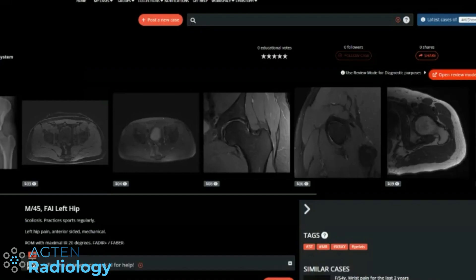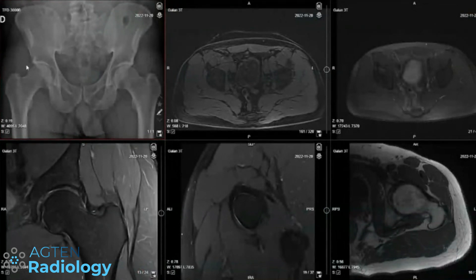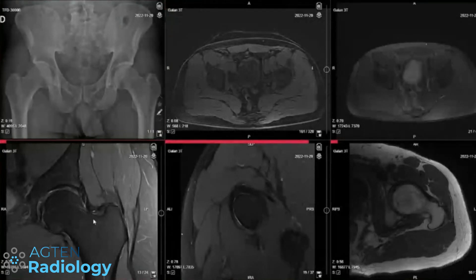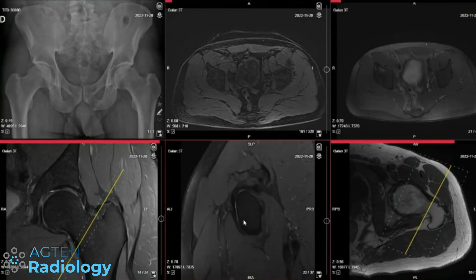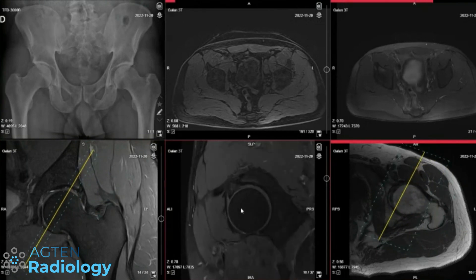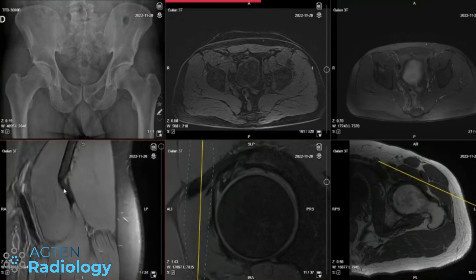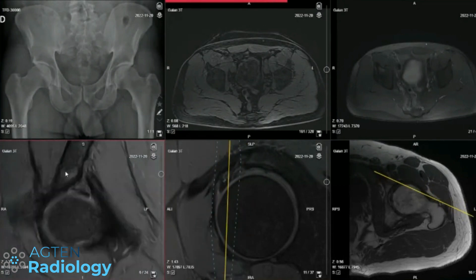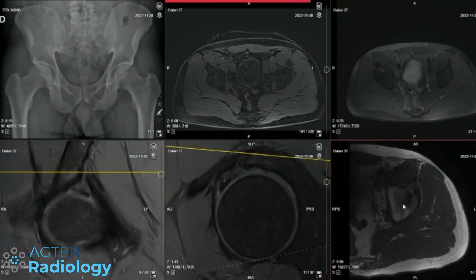The suspicion was femoroacetabular impingement and there clearly is labral pathology. The labrum is very degenerated — it's the left one again — and torn on the anterosuperior quadrants. My main question was: what's the deal with the insertion of the rectus femoris tendon? I see that sometimes and I don't really know what to make of it. The insertion itself — there's a little bit of fluid there.